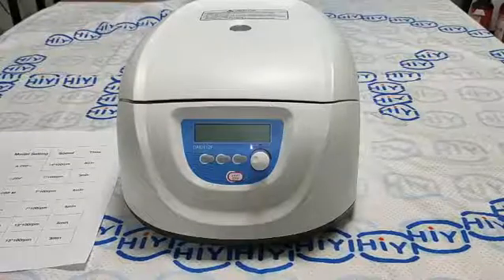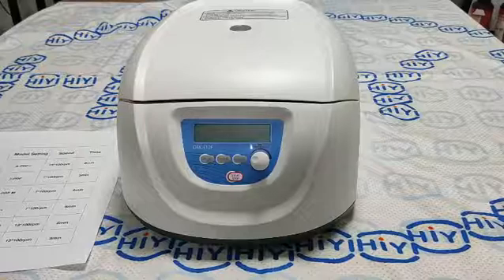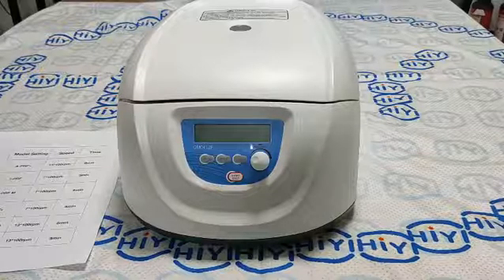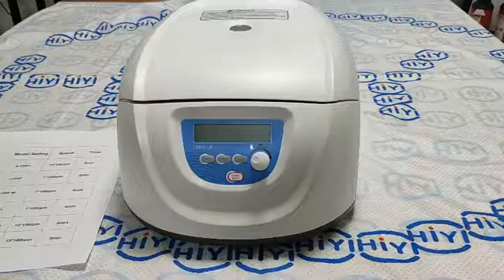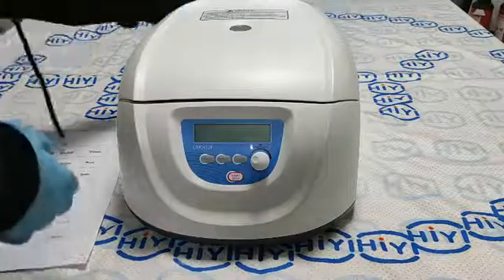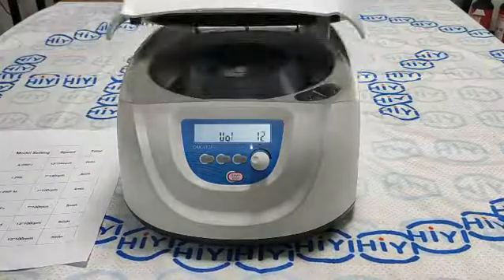This is centrifuge DM0412P. Today we are operating it. First, we open the power. The door is open.